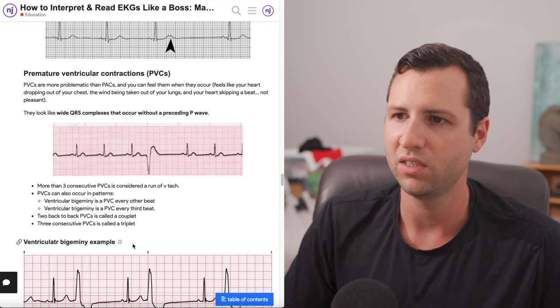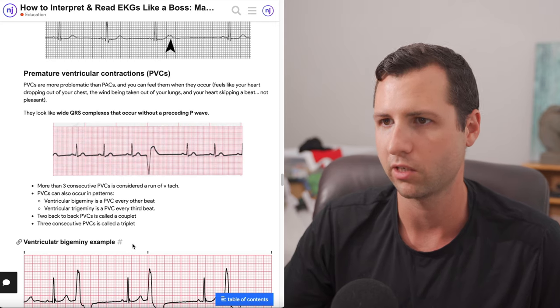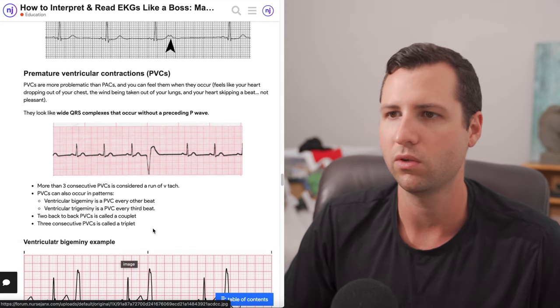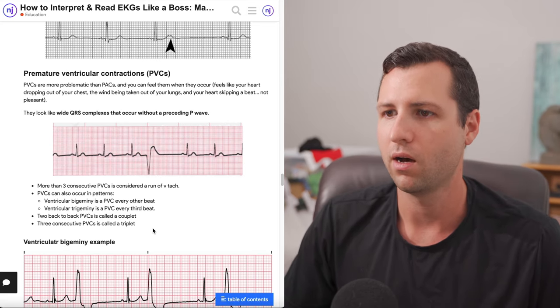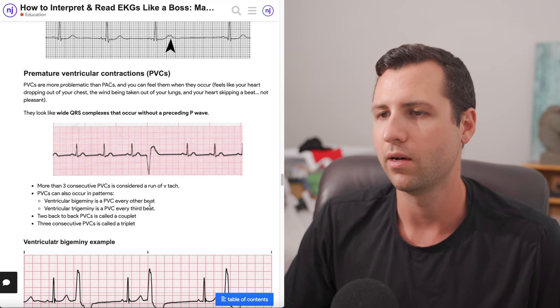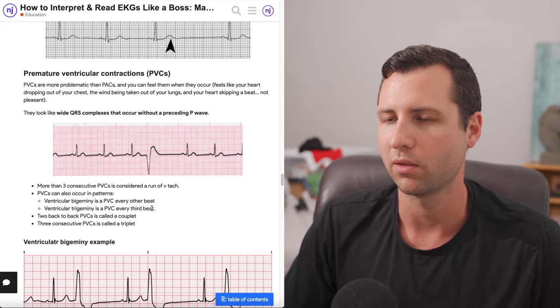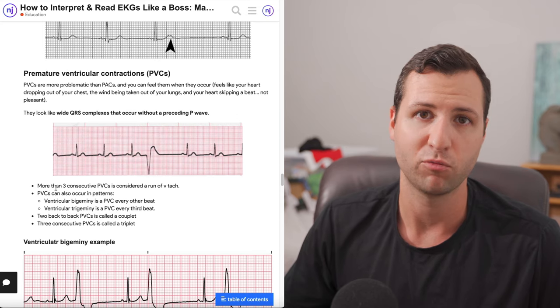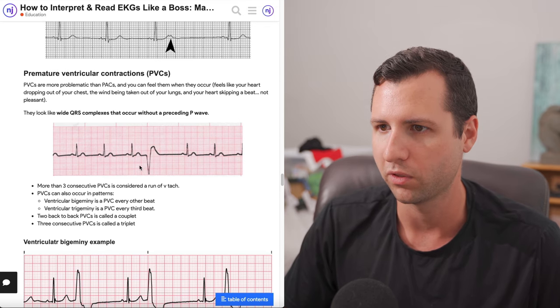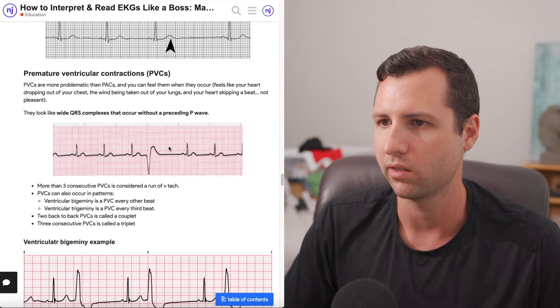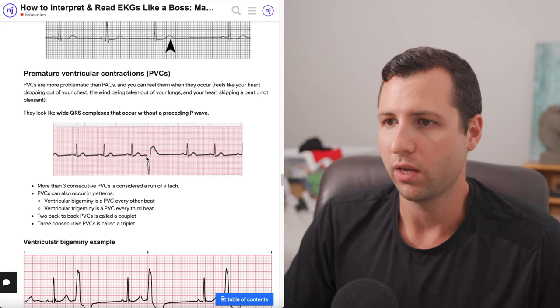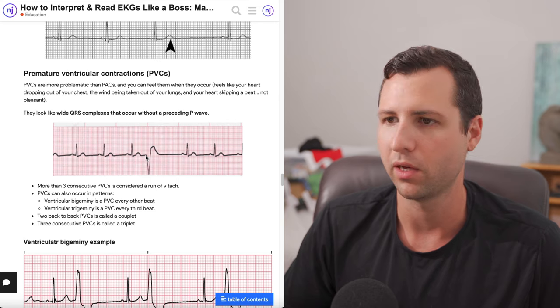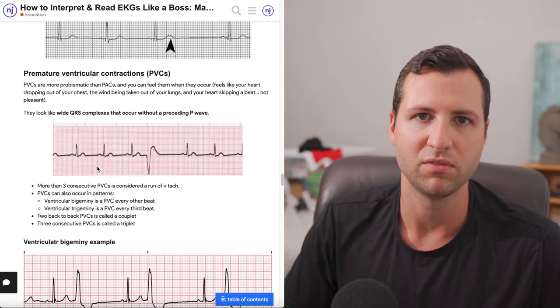Now let's talk about PVCs. These are a lot different. Instead of the atrial contraction that's going prematurely, this is going to be a ventricle contraction that's happening prematurely. These are going to feel more often than PACs. These might feel like your heart's dropping out of your chest, you're losing your breath or something like that. Look at this example here. I'll bet you guys don't even have to have me tell you what the PVC is - this giant PVC. We know it's a ventricular beat because look how wide this thing is. Its QRS complex is super wide versus these tiny, narrow, normal QRS. And we have no P wave.